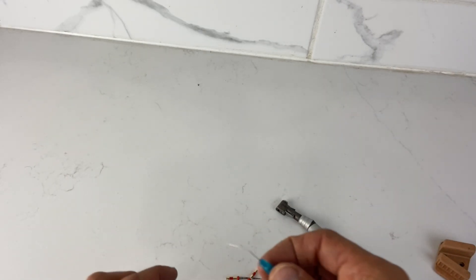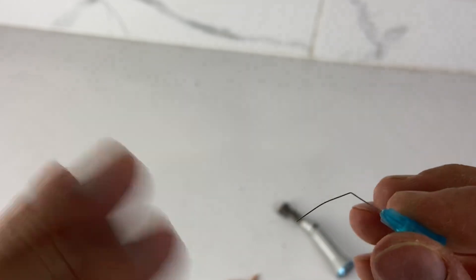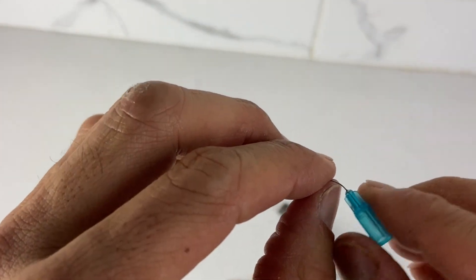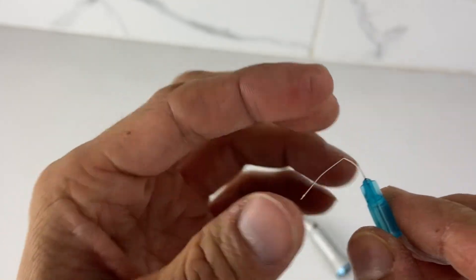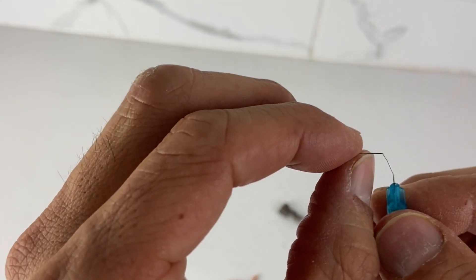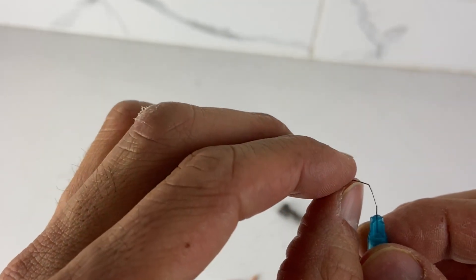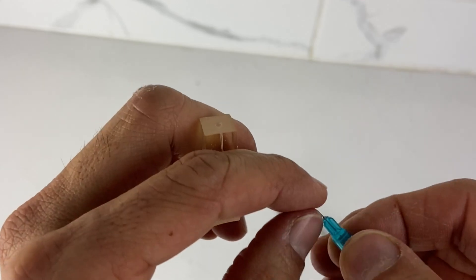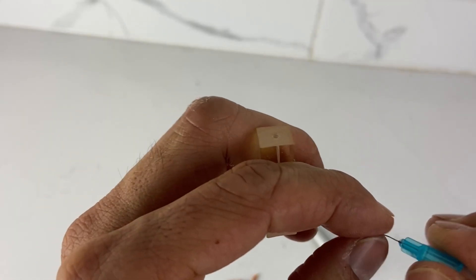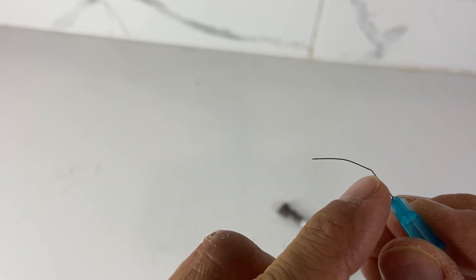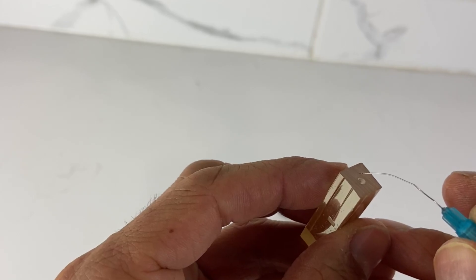So the next thing is with irrigating syringes. So I'm always going to bend it at 18. I don't know why, that's just been a normal length, but sometimes they're hard to get in. So what I'm going to do is I'll bend it accordingly. And then actually sometimes what has to happen is a bend here, with the idea to sneak it into that orifice.